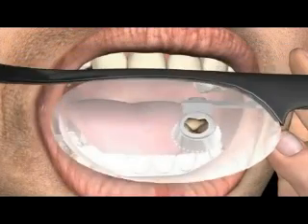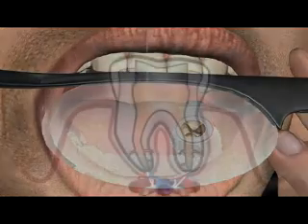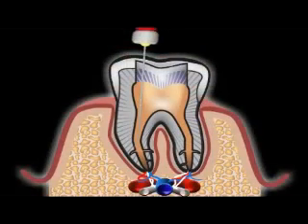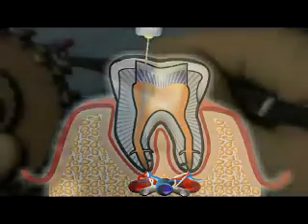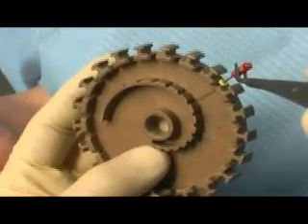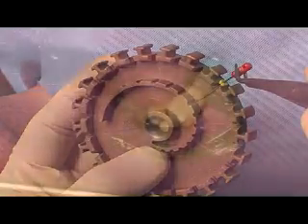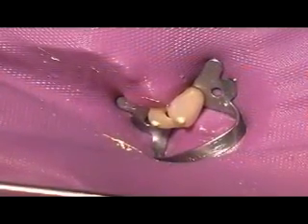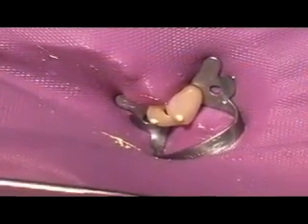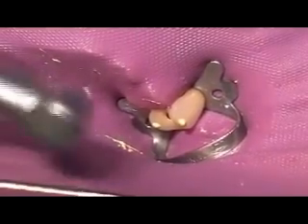The dental canal must be fully reconditioned all the way to the root end. The length of the root is ascertained by means of X-rays and measuring aids, as can be seen in this image. Only a well-reconditioned tooth filled all the way down to the root end can be preserved permanently. If the tooth has a strong foul odor, if pain is experienced, or if there is severe bleeding from the interior of the tooth, then a final filling of the tooth's interior should not be done.